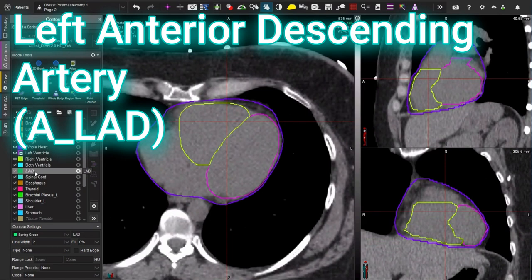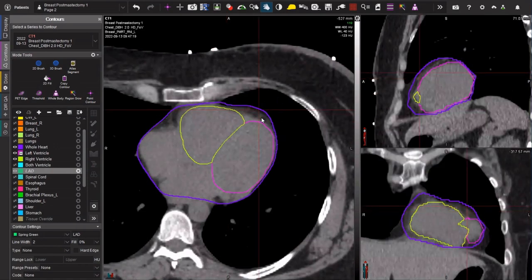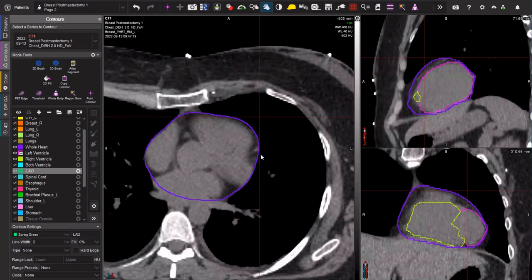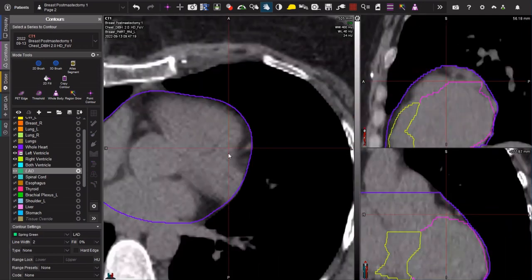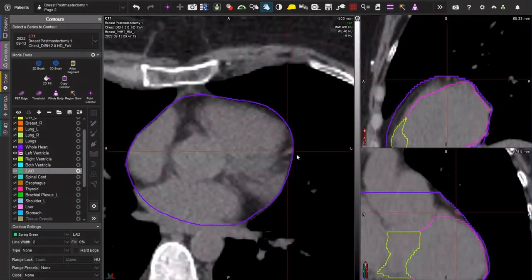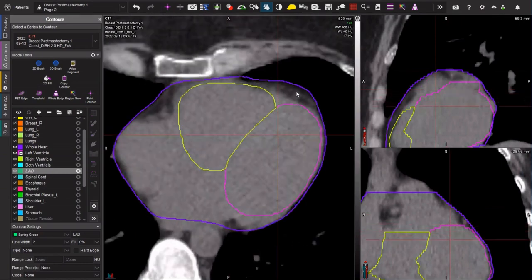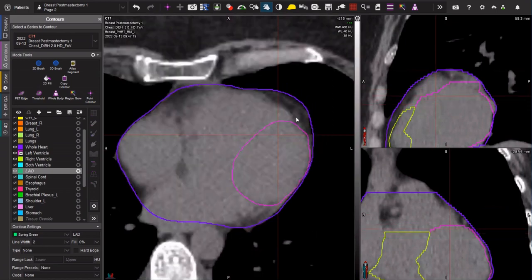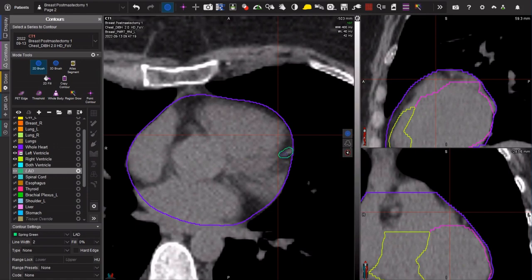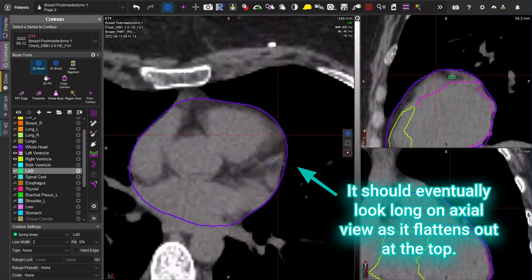Now we get into the LAD — the left anterior descending artery. It's going to be supplying the left ventricle, it's going to be anterior, and it's going to work its way down as it descends. Once you see it and know where to look for it this becomes easy, but the first time it is a little bit tricky. You want to look on the left side and look for a pocket that's surrounded by darkness where there's a little dot — if you can follow it as it goes down, that's your LAD. In this case I can see it here and this is what I'm going to contour.